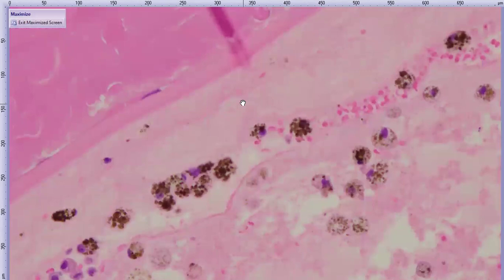We can see the lens epithelium has migrated towards the posterior portion of the capsule. So that's posterior migration of the lens epithelium. And we have these degenerate lens fibers. So we've got these big pools of liquefied lens fibers, or Morgagnian globules, because they don't have any nuclei left in them. And so a nice cataract formation here.